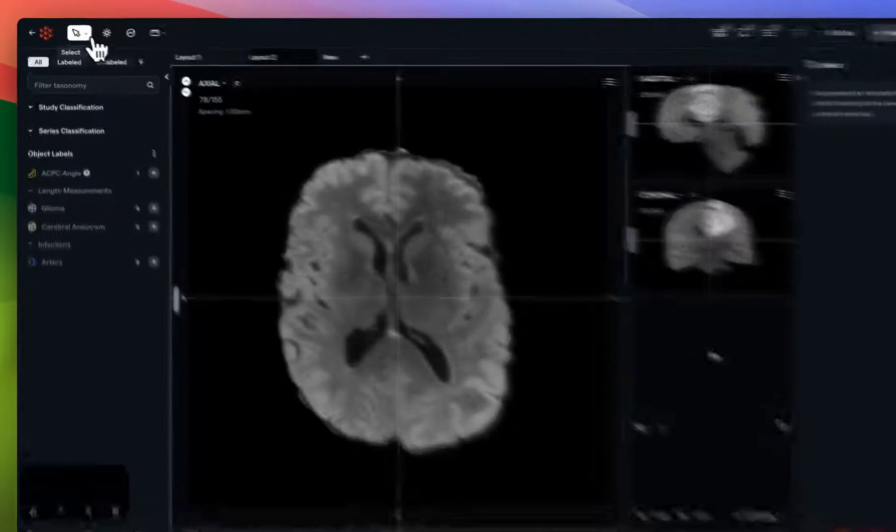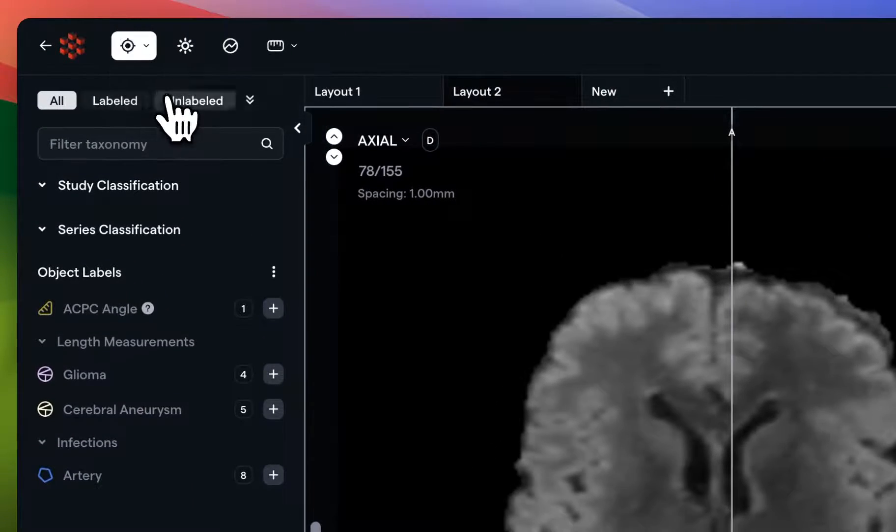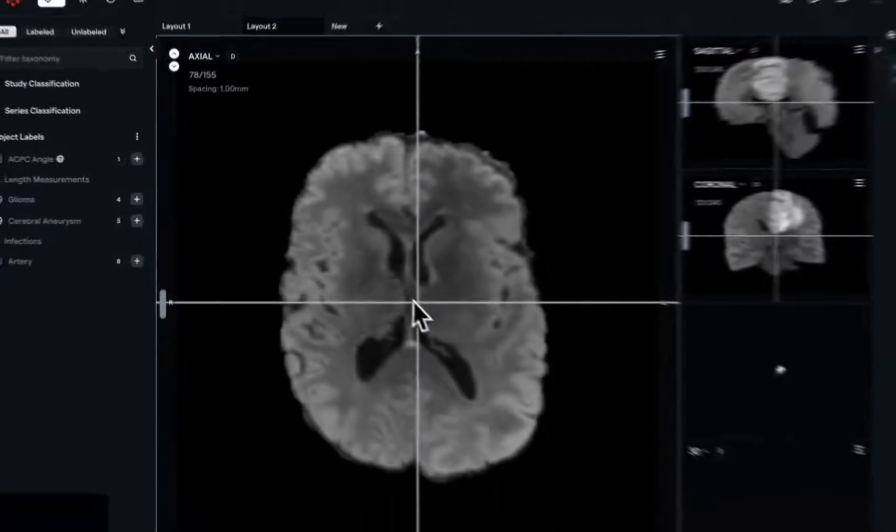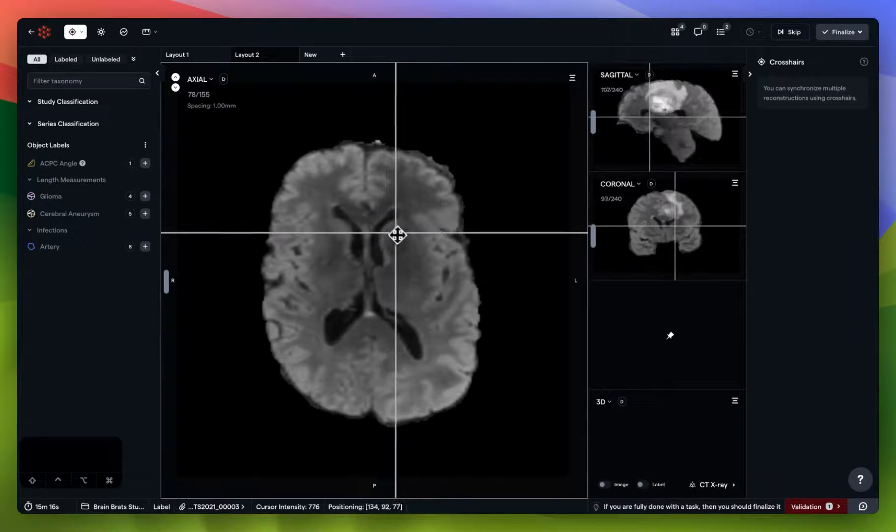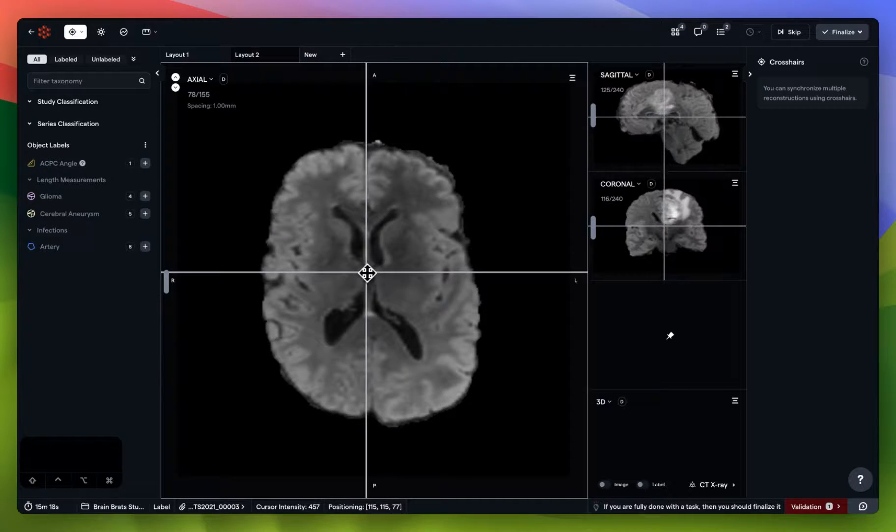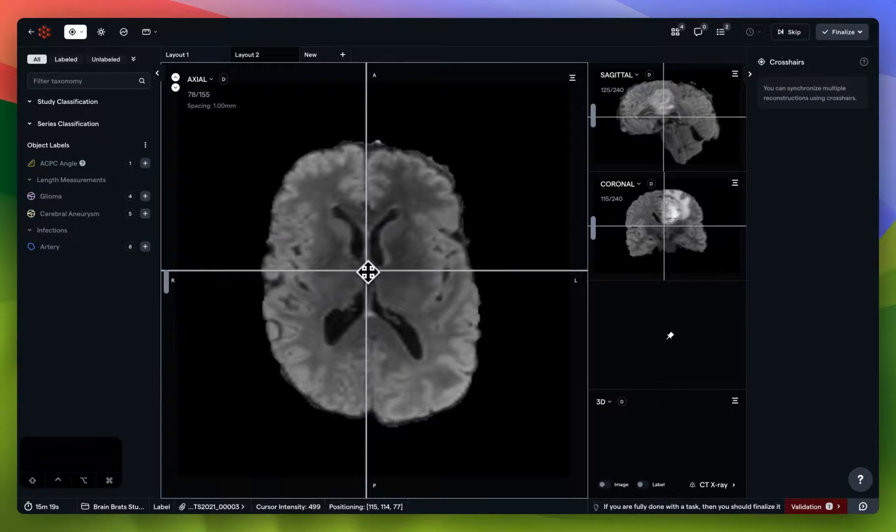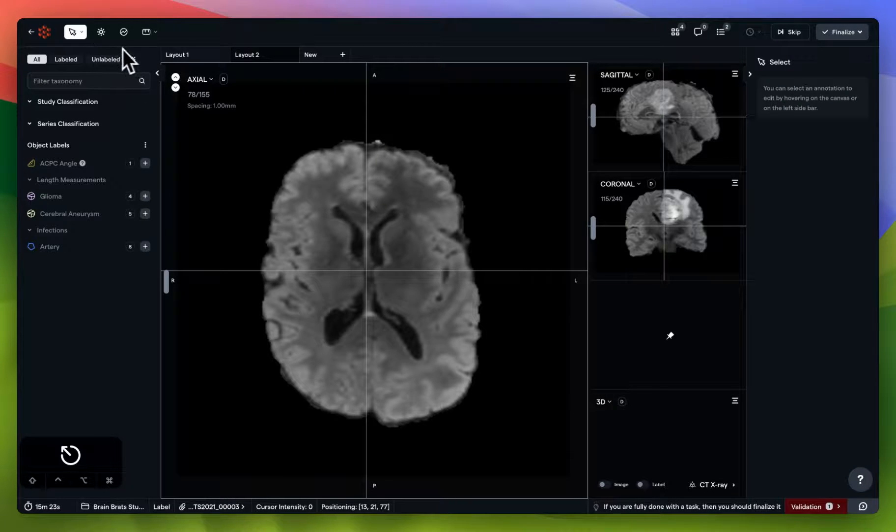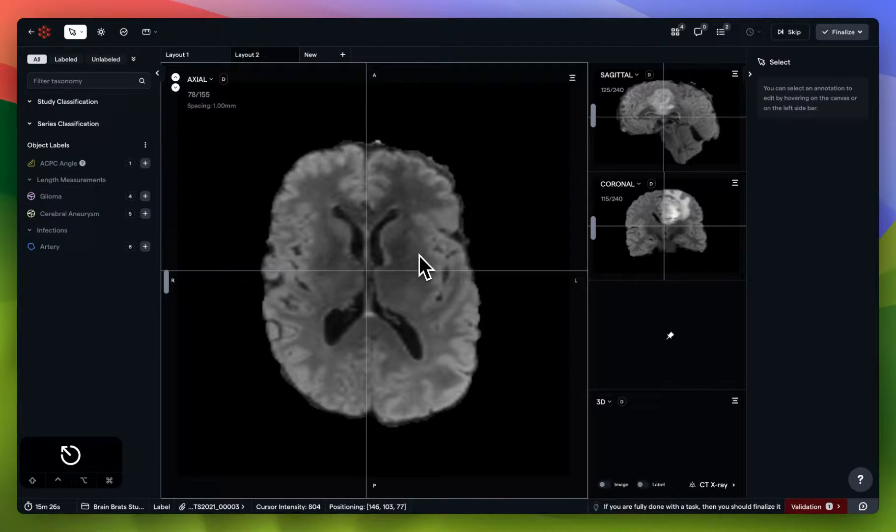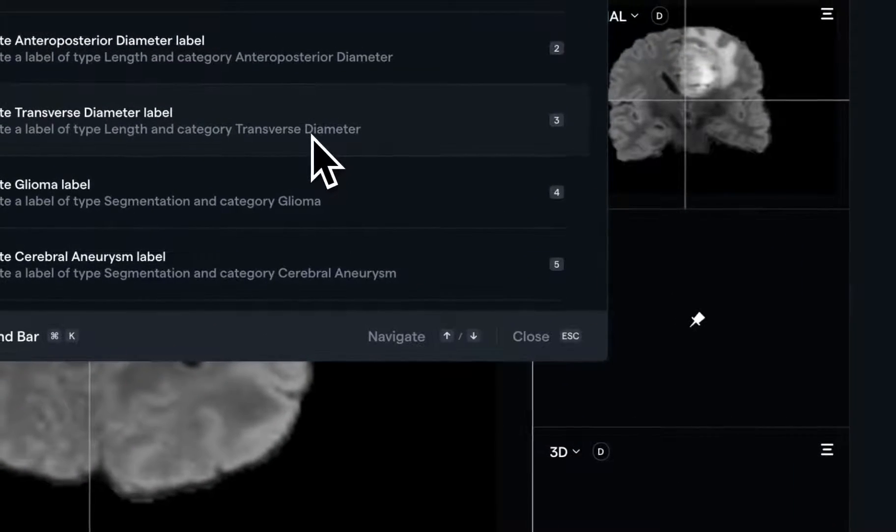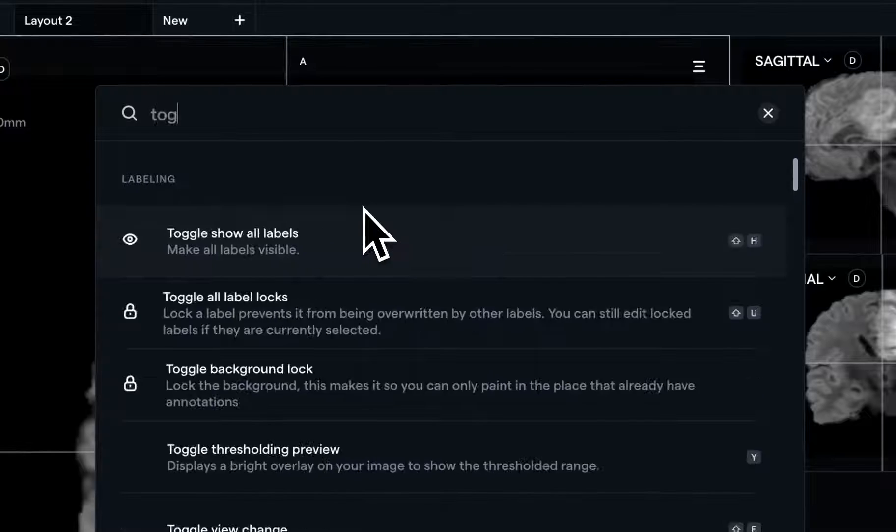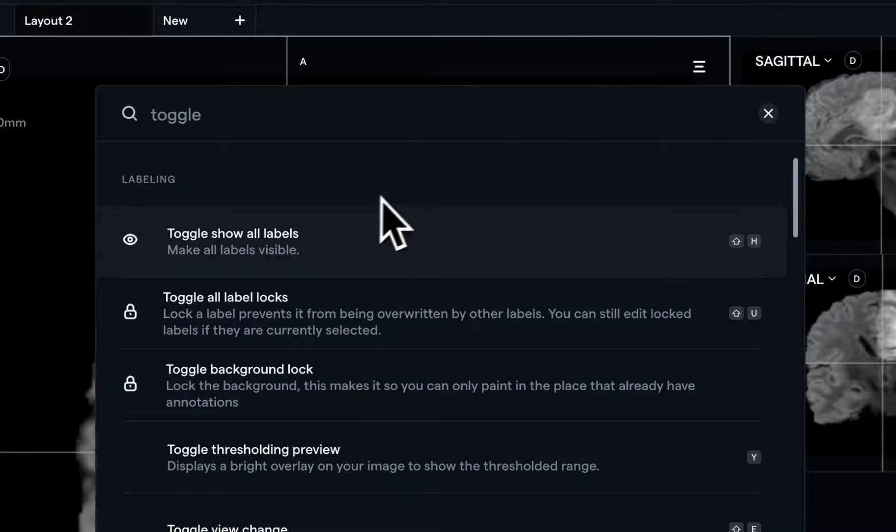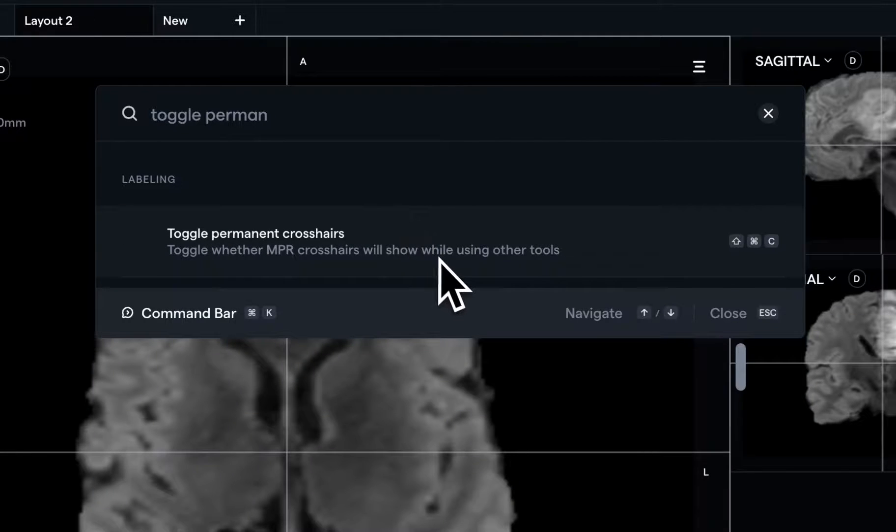In the top left, you'll also see that crosshairs have been enabled for easy access and reference while annotating. Please bear in mind that you can either disable the crosshairs by going back to the select tool, or using the command bar in the bottom right, or by using Ctrl-K, to toggle permanent crosshairs at any time.